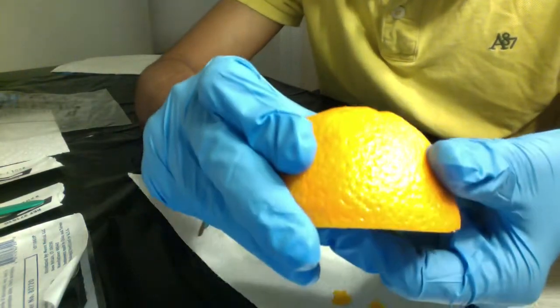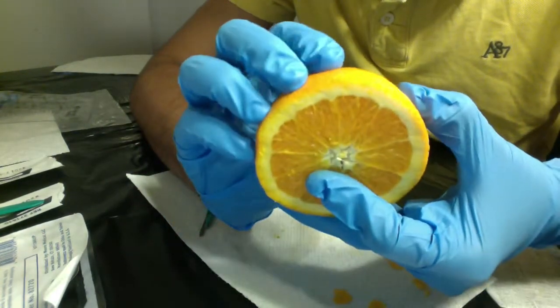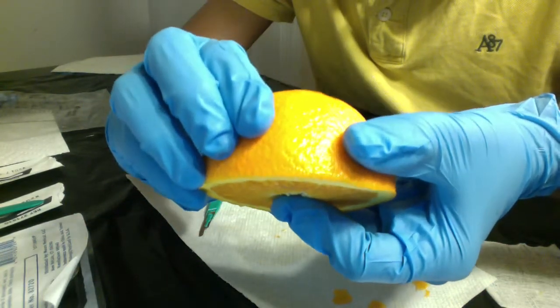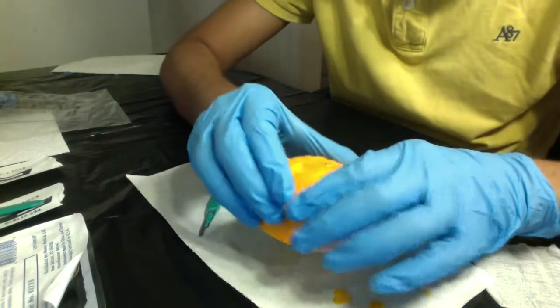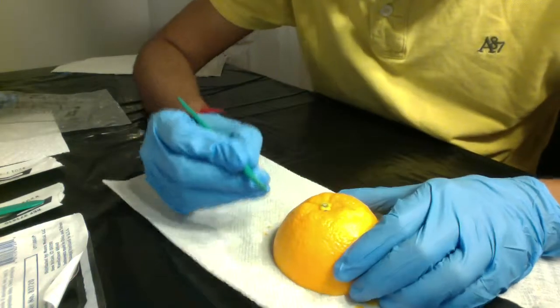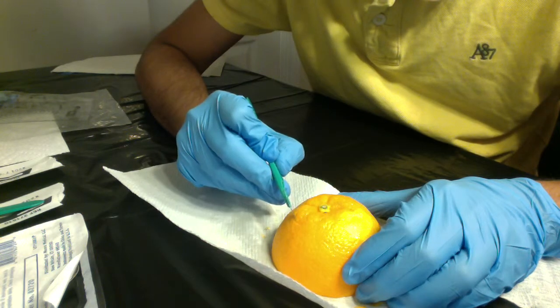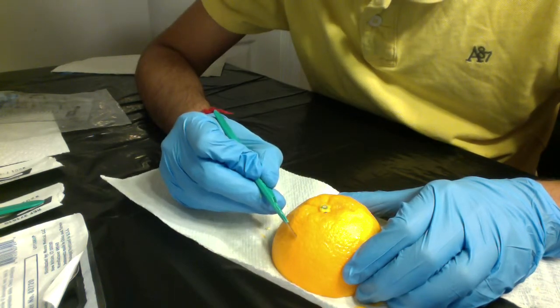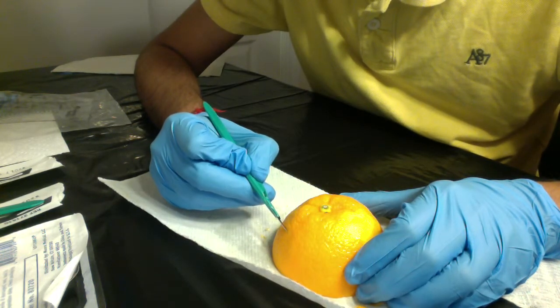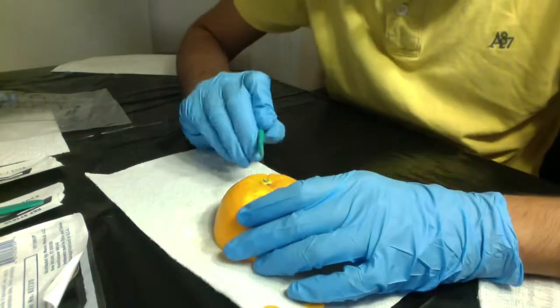Try and demonstrate. It does not have a dye, so it might be a little difficult to see. Just gonna demonstrate again using the pencil grip, making sure to use the curved edge of the scalpel rather than the tip. In a tic-tac-toe fashion, 3 vertical and 3 horizontal.